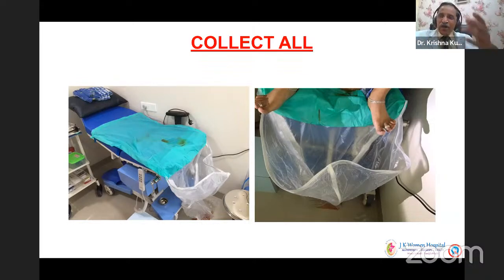But what falls out of the vulva and the perineum is difficult. And one should know the capacity of your suction bottle. It could be 800 ml, it could be 2 liters. And from there, it goes into a bucket. So there is a person at the receiving end. You have a dedicated person to do that.